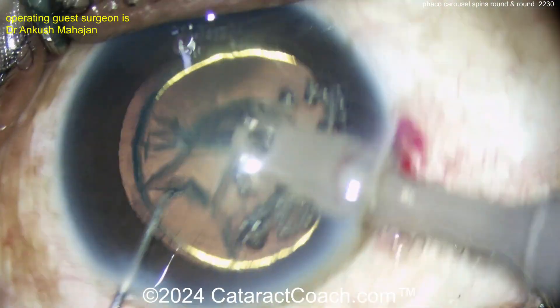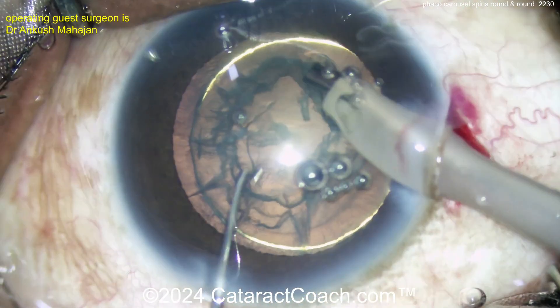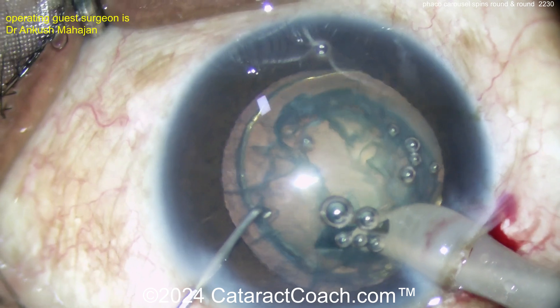Here comes the phaco probe. Now going in here, look at the angle of the probe. Cleaning this up a bit. You want to put the vacuum to the side, and therefore this thing will just rotate. Watch — look how that works. Rotate, rotate, rotate, rotate.